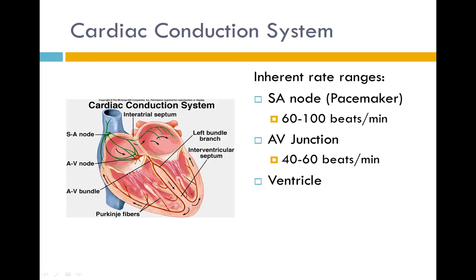If the heart rate falls below 40, the conduction or the electrical stimulus is coming from the ventricles. The client with a ventricular rate, obviously 20 to 40 beats per minute, is probably not doing very well, probably lacks some perfusion, and will need immediate interventions. Again, if that pacemaker isn't working, we're going to have to take over it.